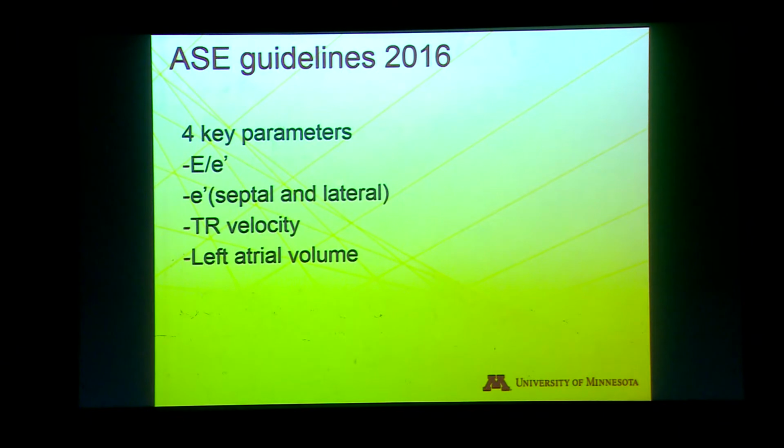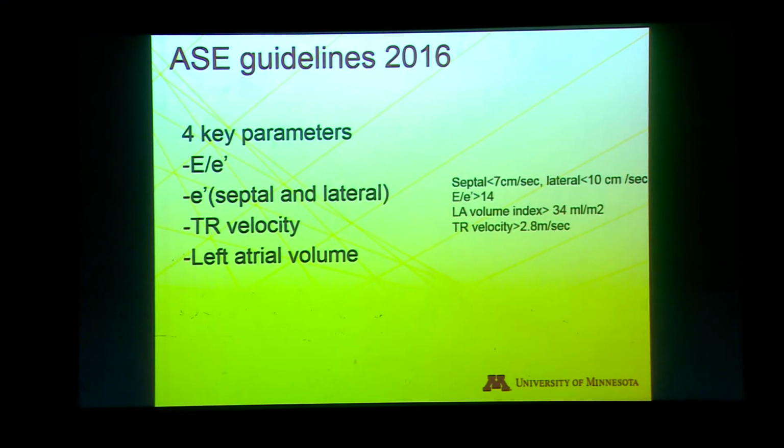So people who practice transesophageal echo, how many times have you calculated the left atrial volume? I haven't. So it's not easy, right? But this is part of the guidelines here. That throws things off a little. And these are the magic numbers.